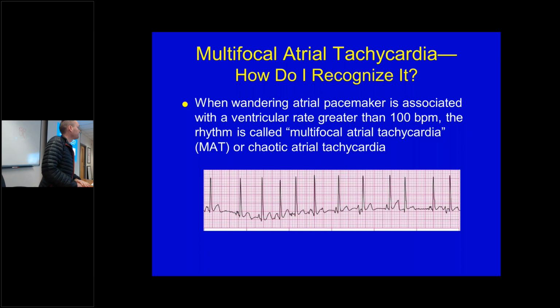It's just a dip in the P wave. See how it kind of comes off the baseline? You mean it just dips down about the same point? Is that like a global ventricular? Oh, that might be respirations. That might be just the patient moving. It doesn't mean you can't compare this isoelectric line with this isoelectric line. I was wondering if it was something from the heart. Right, it could be the heart.